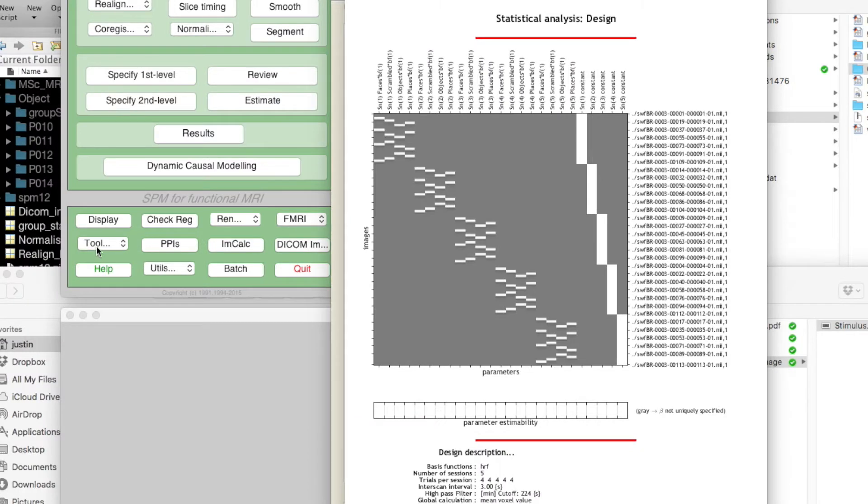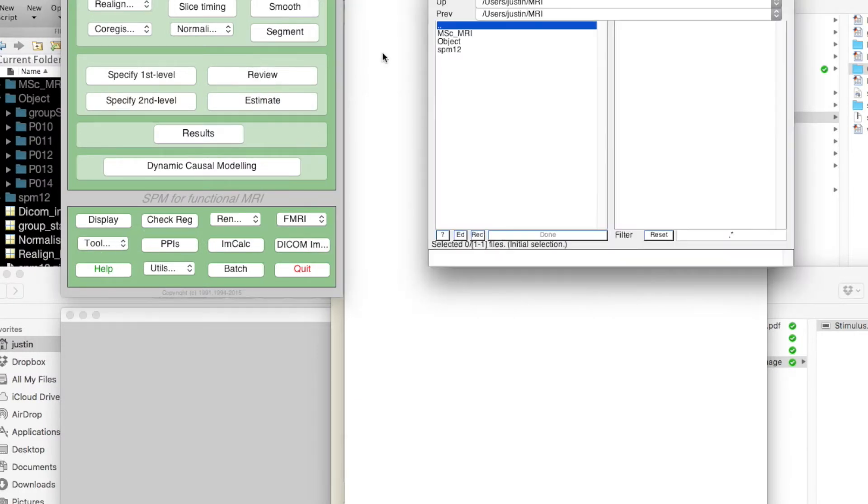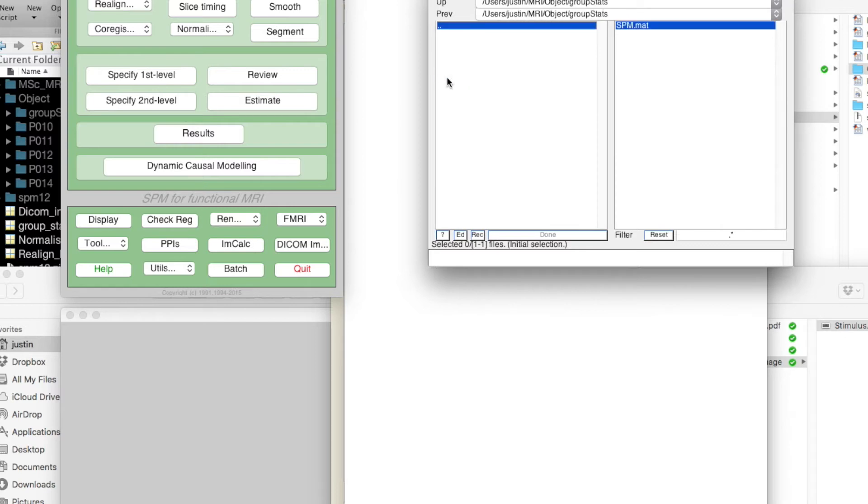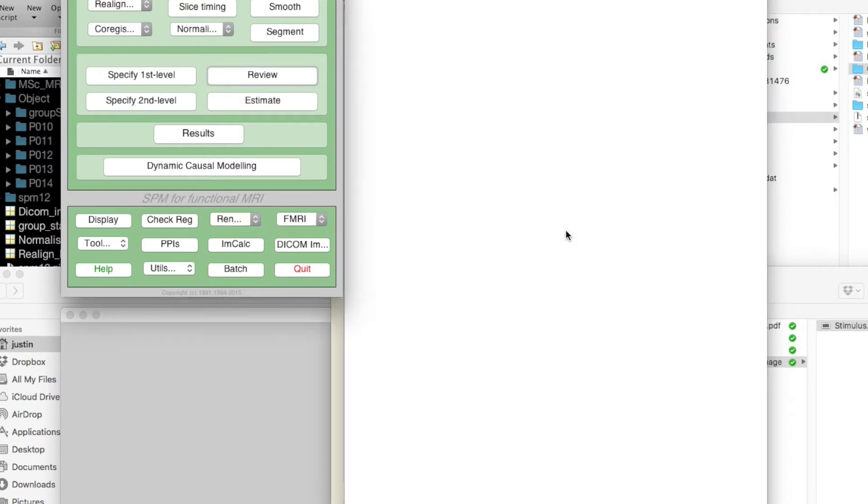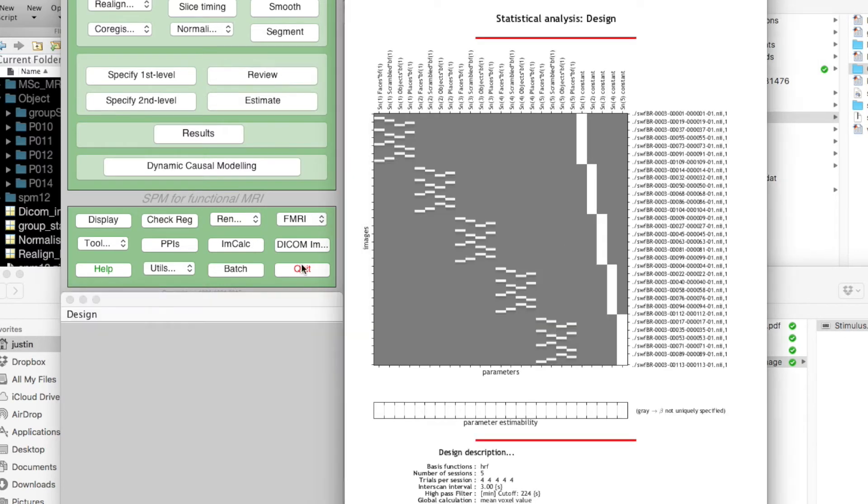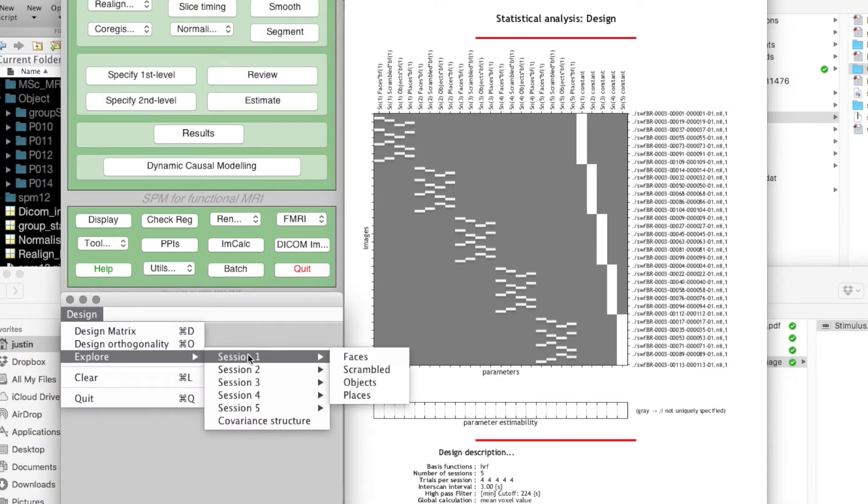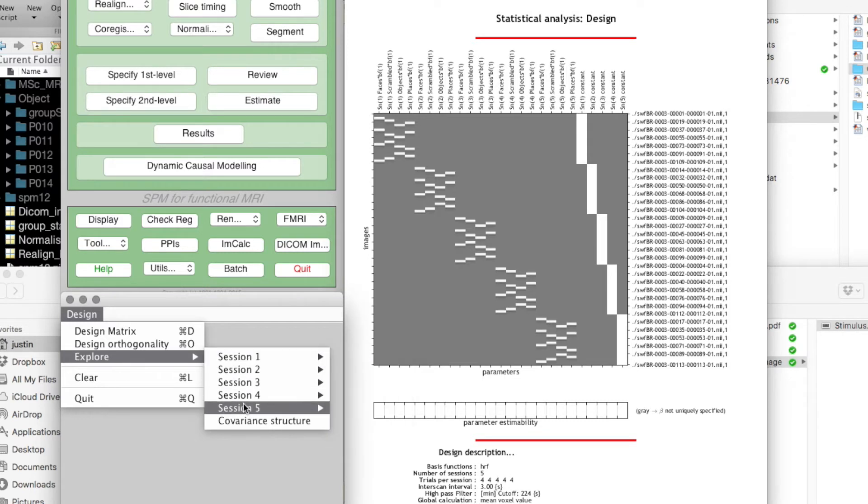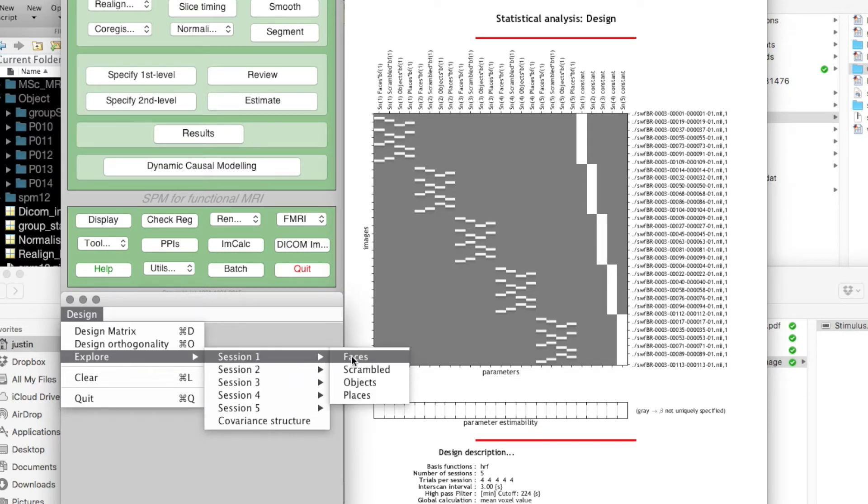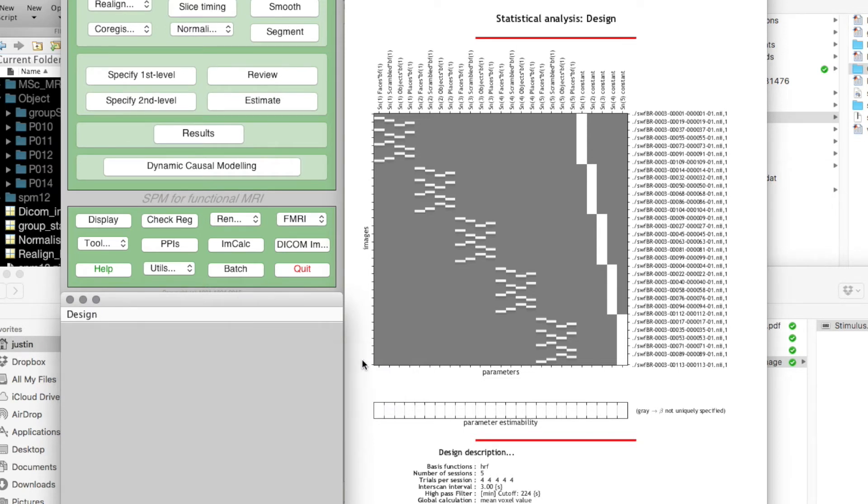We can take a look at one of those now. If we click on the review button and select where we told you to put the SPM.mat file, it comes up with the same summary but we can now explore for each of the five sessions—that's the five different participants—we can see how each of the four conditions or regressors is specified.